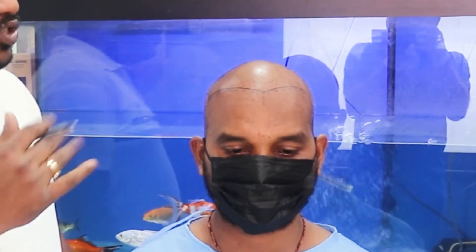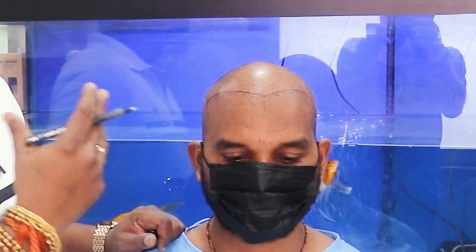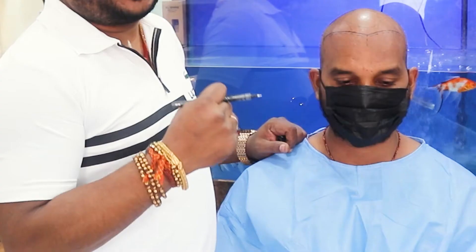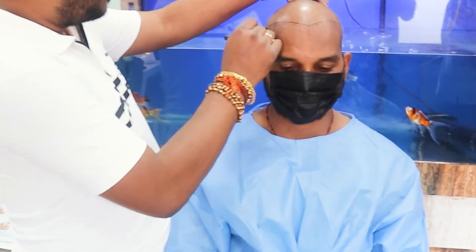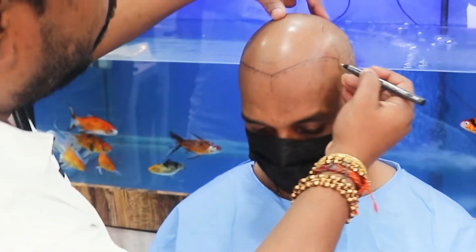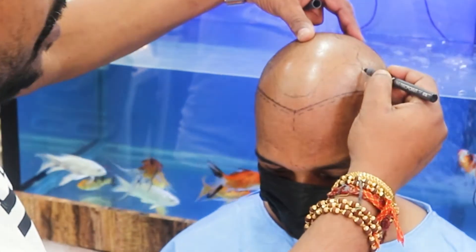This is our hair transplant case at our Balaji Super Facility Clinic and Academy. We have a very good case today and we are going to give very high density grafts by DSM. We will be giving the grafts from here through to the frontal temporal region, where the high density pattern will be applied.